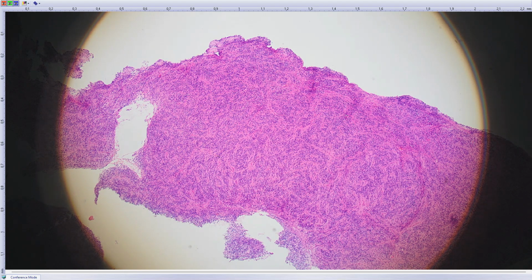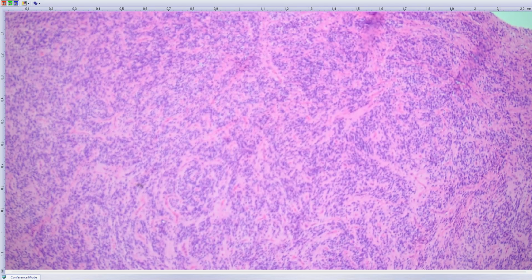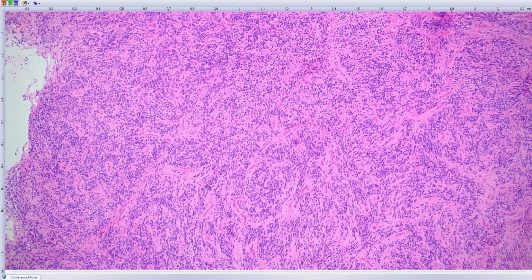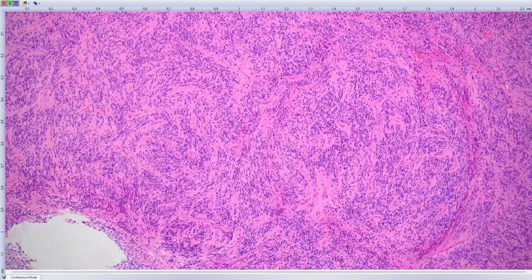The first one is a tumor from the brain. It's a supratentorial tumor in an 11-year-old girl. And that's all I know about the patient, and the case was sent with the correct diagnosis. I don't know if anyone wants to guess the diagnosis.